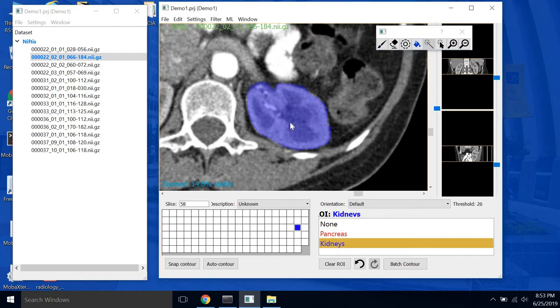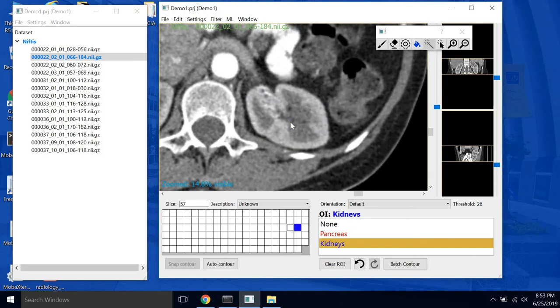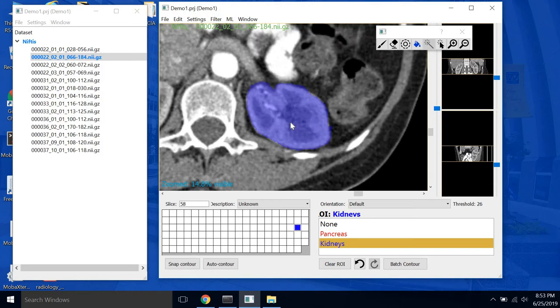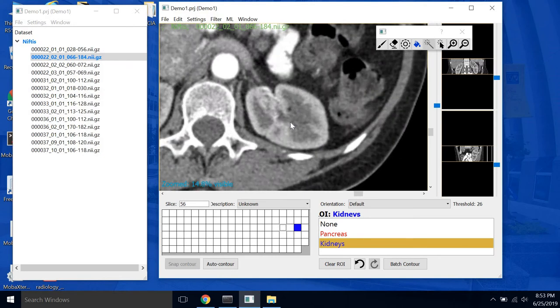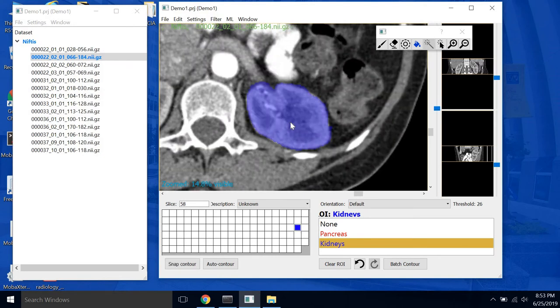Now to move on to the next slice, you can either scroll with the mouse scroll wheel or use the left and right arrow keys.